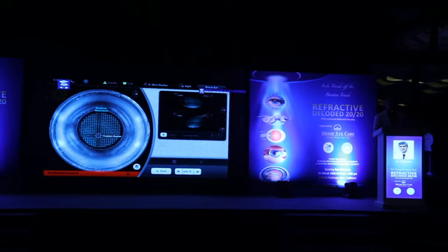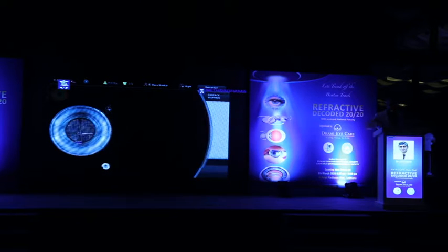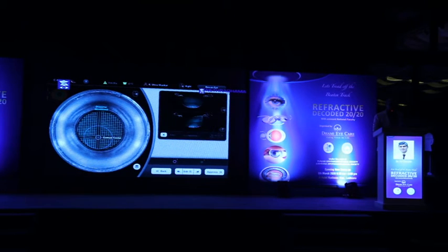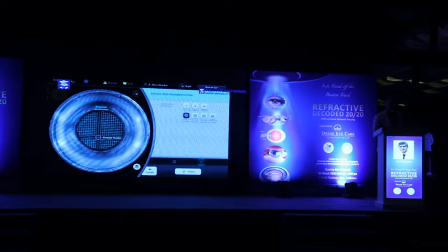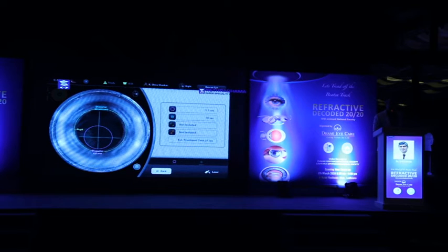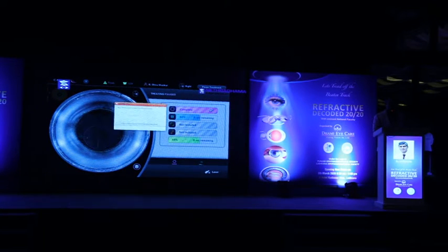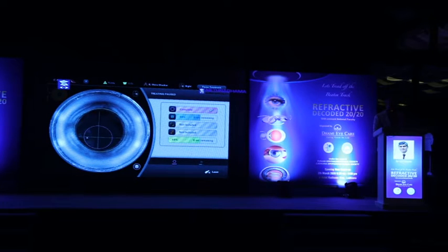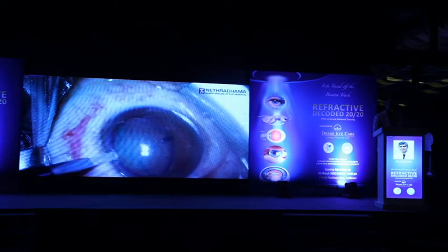You may also have to reduce the size. There is an extreme degree of subluxation, almost 270 degrees, with quite a bit of tilt. The advantage of the femto is you can customize and get a perfect rhexis. You can offset the rhexis, which is most important if you want to maintain the bag. That is the offset rhexis. Then we do the capsulotomy and nucleotomy.